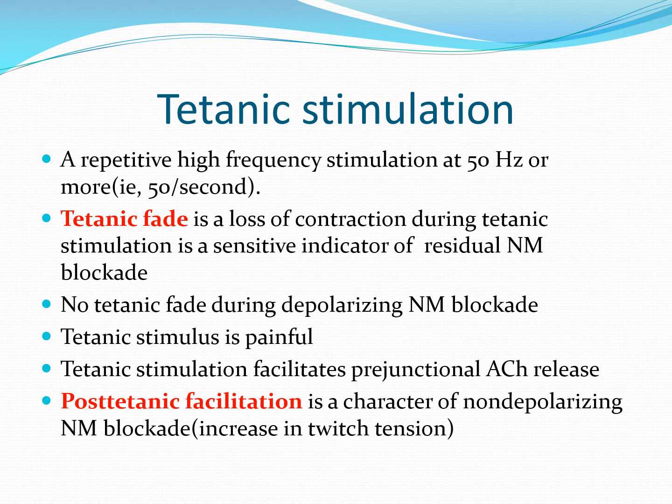The tetanic stimulation consists of a repetitive high frequency stimulation at 50 Hz or more. 50 Hz means 50 per second. Also, we have what's called 100 Hz, 100 per second.